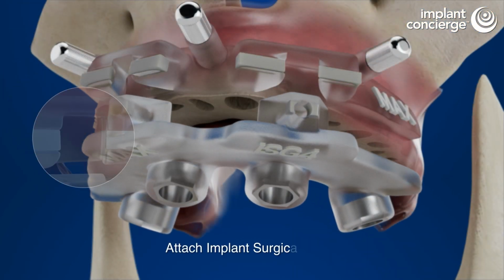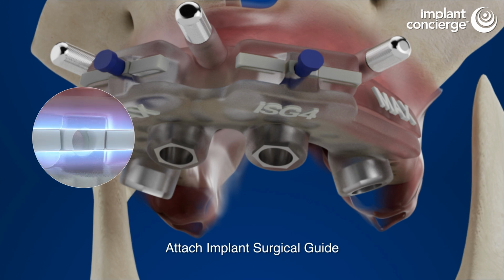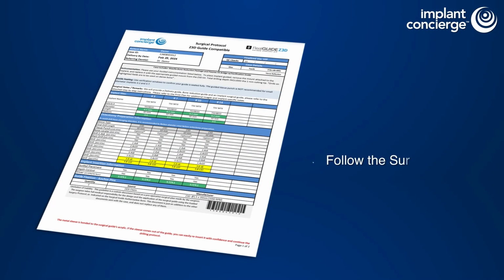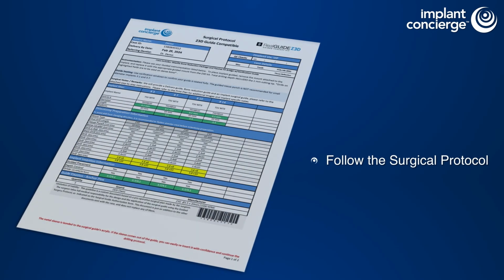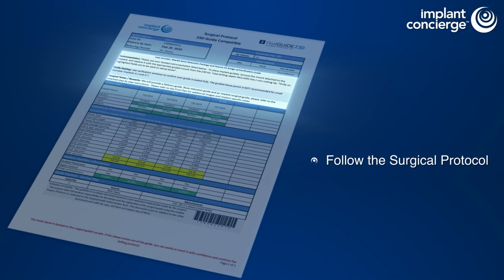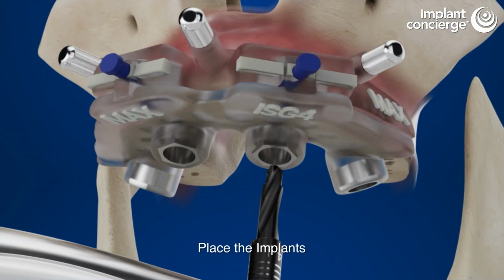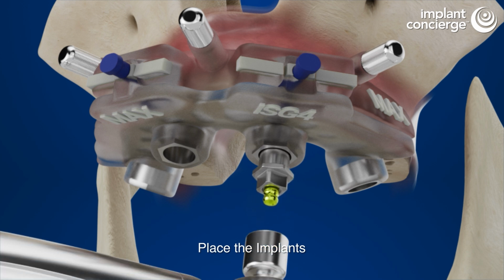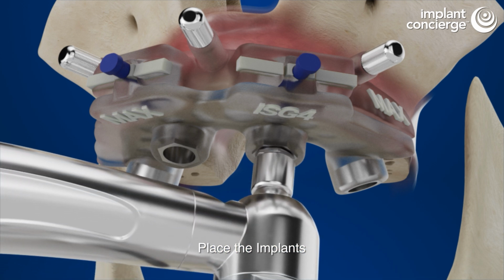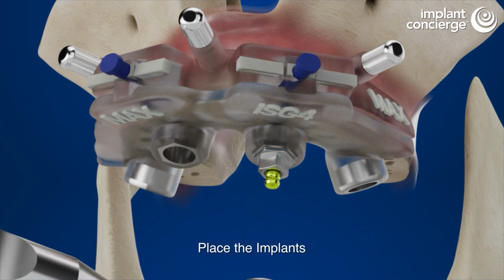Attach the implant surgical guide to the bone reduction guide, securing them with the blue pins and ensuring indicator lines are aligned. Review the surgical protocol notes carefully. Follow the surgical protocol and implant manufacturer's guidelines for precise osteotomies. Fully guided cases allow implant placement through the guide. Align timing marks on the implant mount to the surgical guide sleeve to ensure proper rotation alignment.